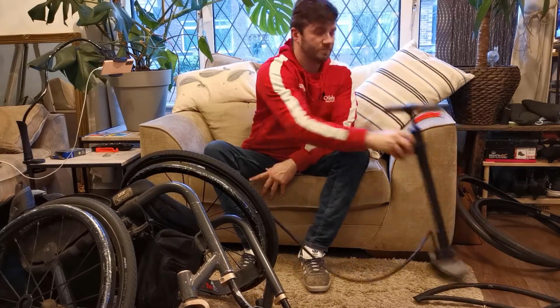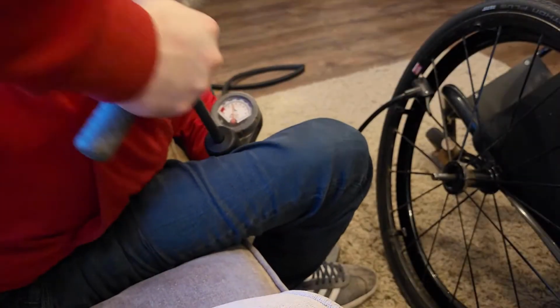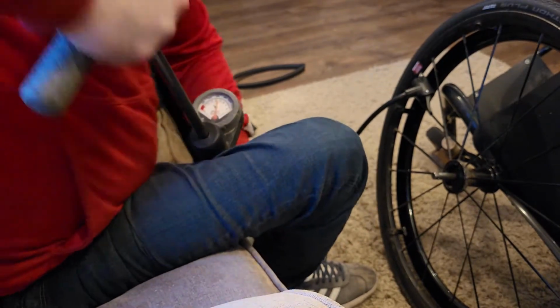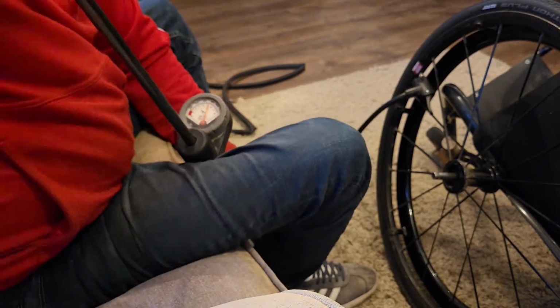Again, I'm not able to stand up and use this foot pump as it's designed, so I have to hold the base with one hand, and then using my weight and my strength, push the lever down until I get to my desired PSI. And I'm going to go to about 100 PSI here. When I slip the valve off, I will lose a little bit, so it'll end up being about 85-90 PSI.